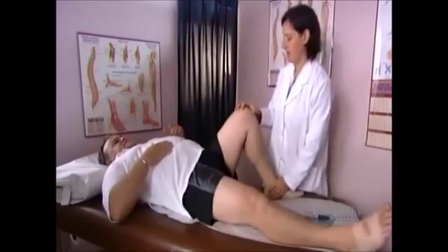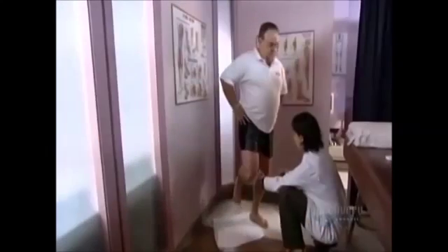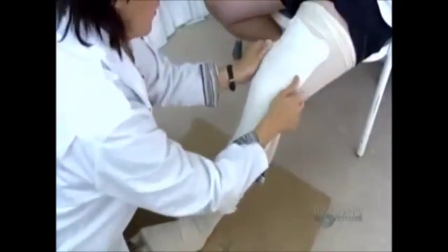This patient has arrived with a doctor's prescription for a knee brace. The orthotist analyzes his mobility, flexion, and balance, then sends the technical specifications to the production department. There, technicians make a model of the leg. They begin by positioning the leg at a 12-degree angle and wrapping it in plaster bandages.